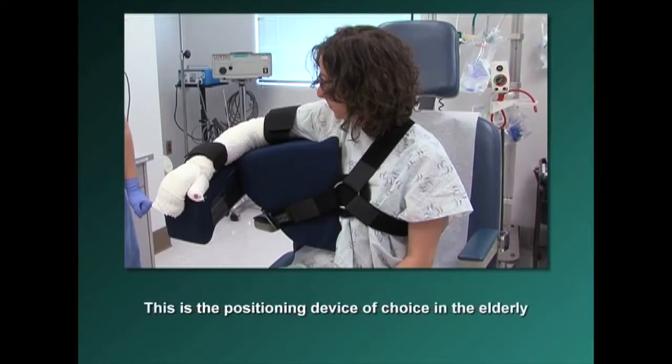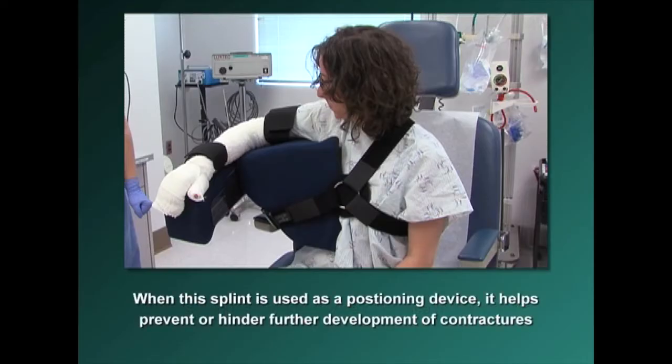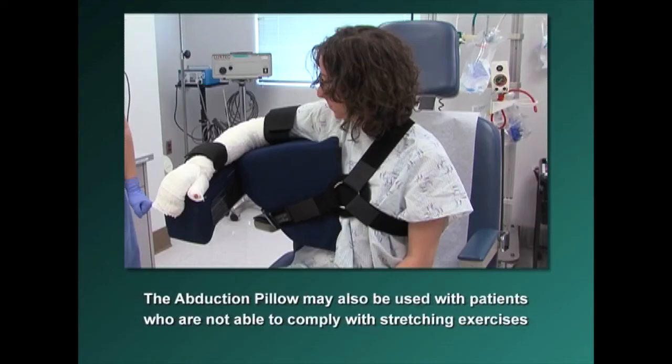This is the positioning device of choice in the elderly. When this splint is used as a positioning device, it helps to prevent or hinder further development of contractures. The abduction pillow may also be used with patients who are not able to comply with stretching exercises.